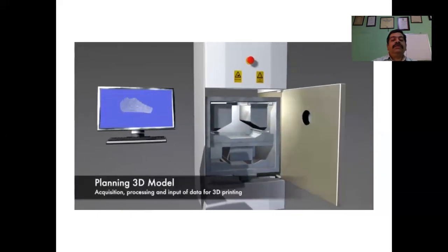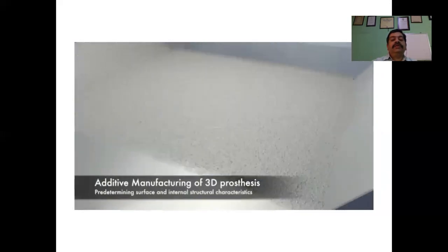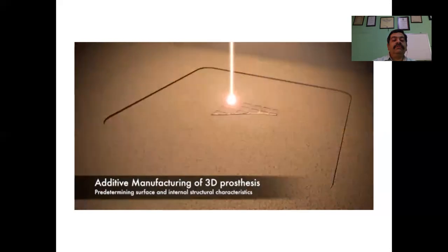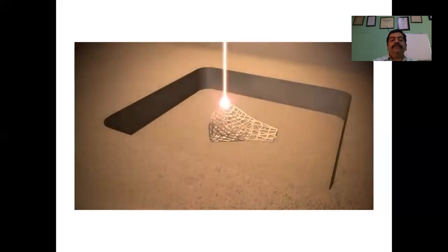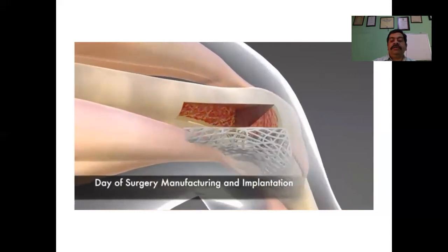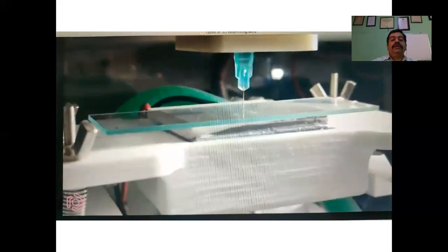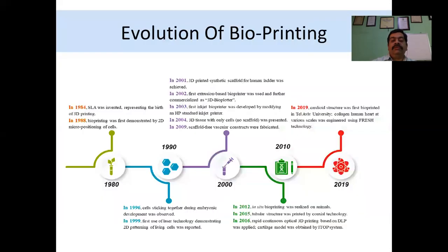So the planning is transferred to an ultra-high speed printer, which creates a hydroxyapatite scaffold. It builds it up by additive manufacturing in a sterile environment, and you can reimplant it and add biologics to the whole reconstruct. And the ultimate is bioprinting. This is a bioprinting video in which you use a bio ink, which is laid down according to the structure you want to make, and you can make a scaffold which has live tissue inside, the cells inside, as well as the scaffold.